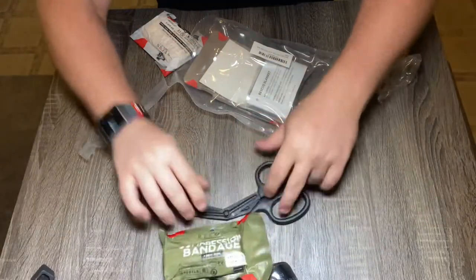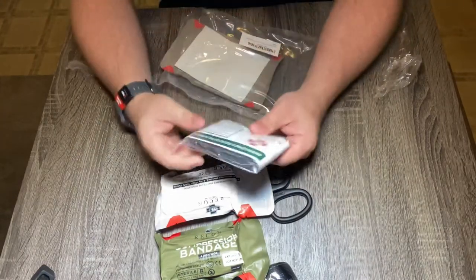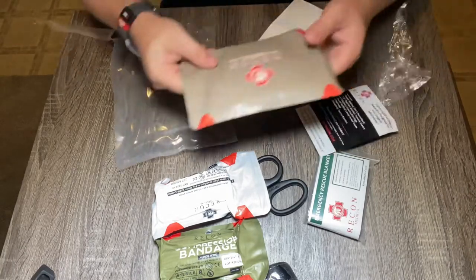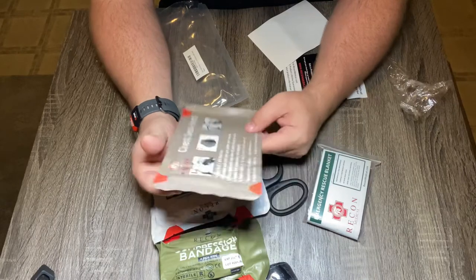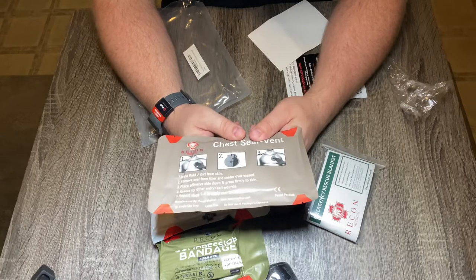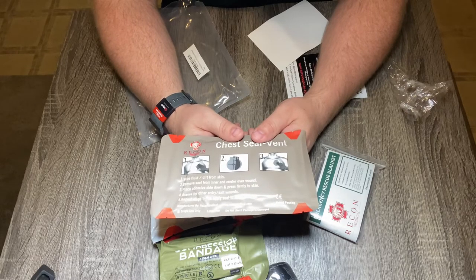It has the Recon Medical branding on it. Next up, we have the compressed gauze. And then this is the emergency rescue blanket. And lastly, this is their version of the chest seal, and this is pretty awesome because it is vented. The benefit of having a vented chest seal is it helps prevent a tension pneumothorax from occurring — it'll allow some of the pressure in the chest to escape.